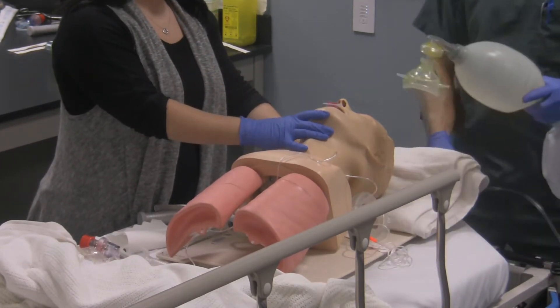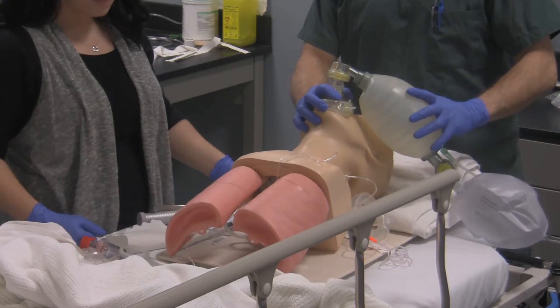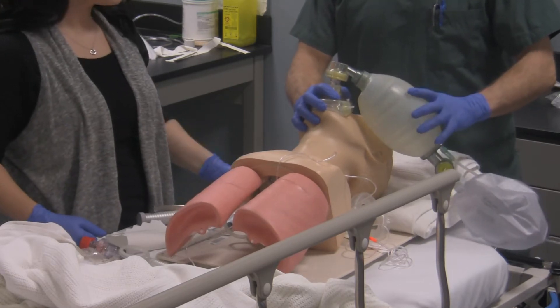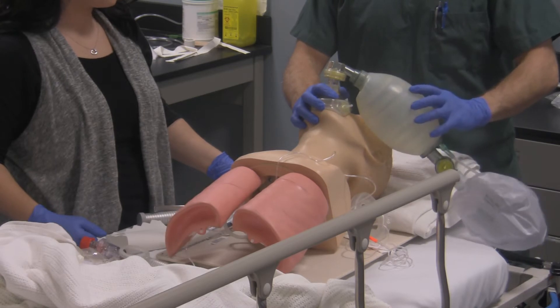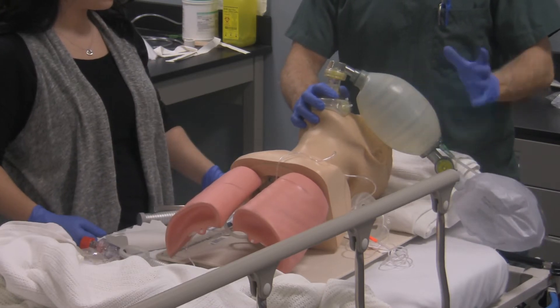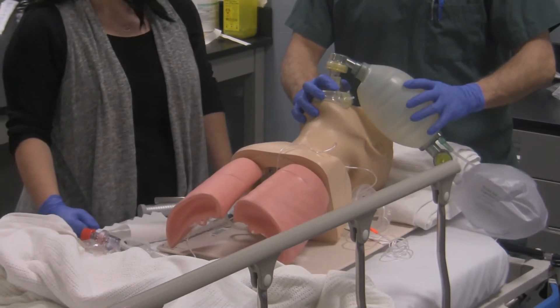Donald, we're going to start resuming the breathing for you again. I do this one to two minutes until the sats come up. Patient looks pink again. And the next thing I want to do, if you had an active pharyngeal reflex or a gag reflex, is what?